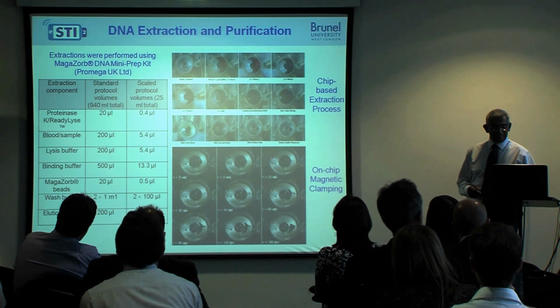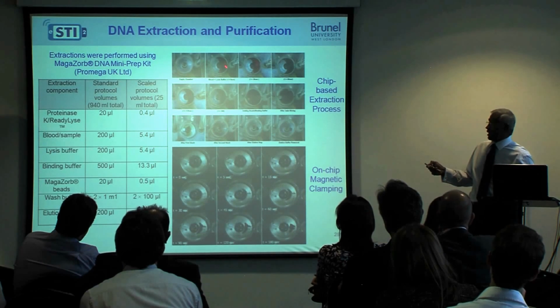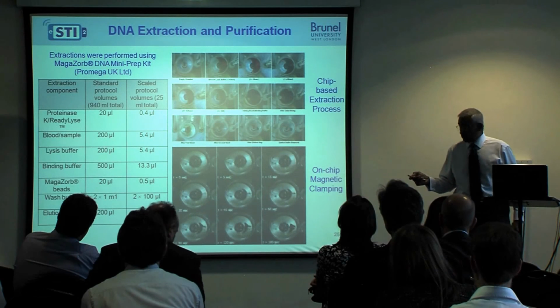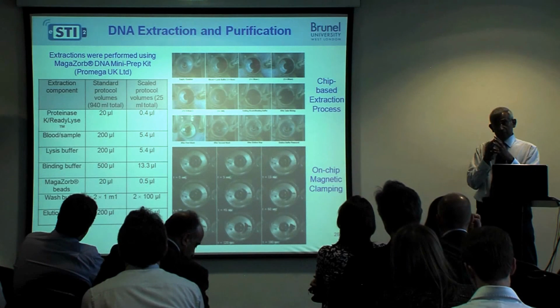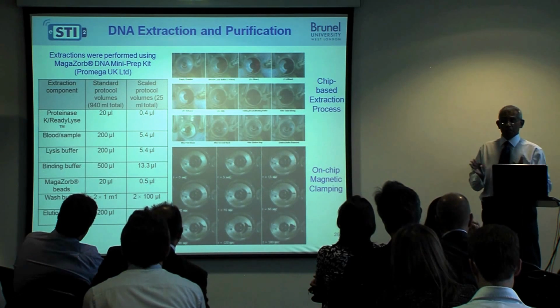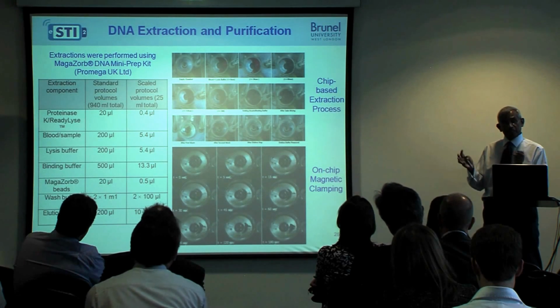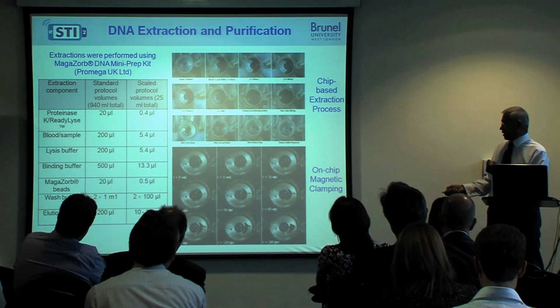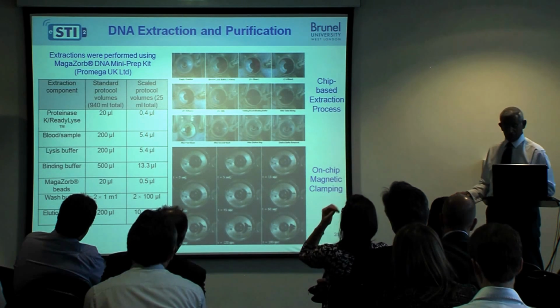This gives you an indication that we can actually use blood. We use whole blood in this case, and then use this mixing to collect the DNA that is released, because the actual lysis process is a well-known chemical process, so I'm sure some of you are familiar with it. When the DNA is released, it collects on the beads, and as a result we can then use a DC magnetic field to collect the beads at one place and wash it through, and then release the beads and resuspend them.